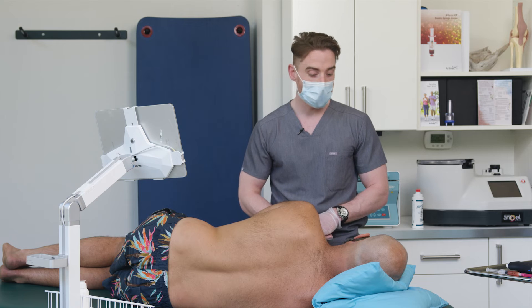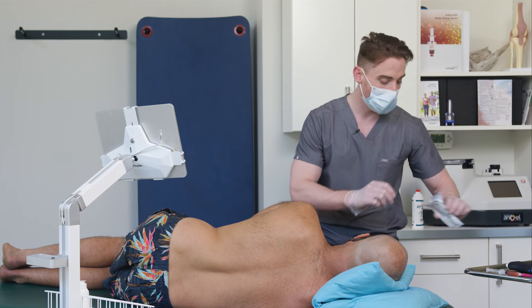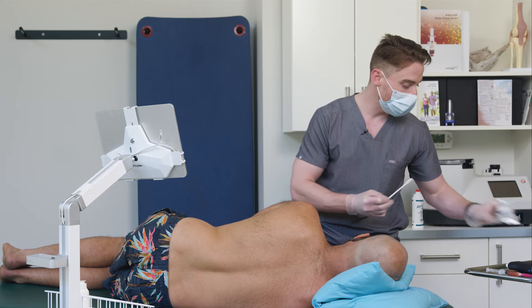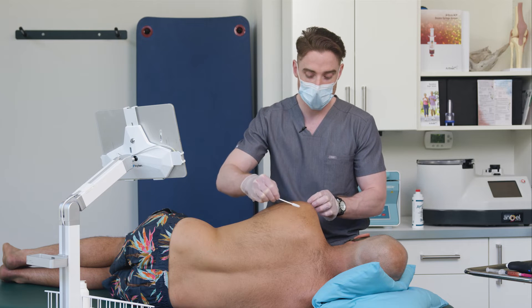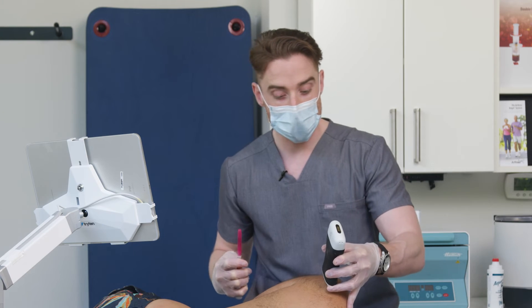We'll go ahead and get Jaden prepped for the injection. We've already prepped a 2% chlorhexidine swab, which is also going to be acting as our transducer medium. Jaden, just a little bit of wetness there.